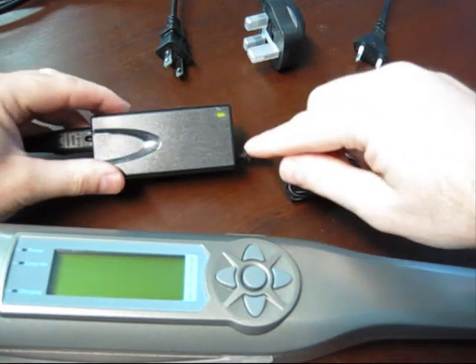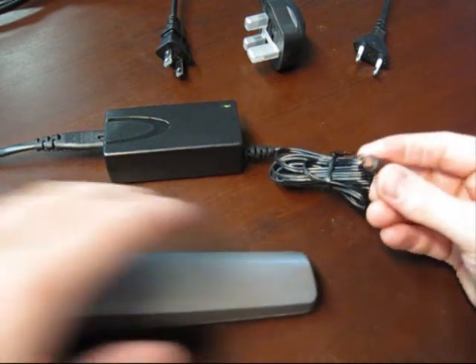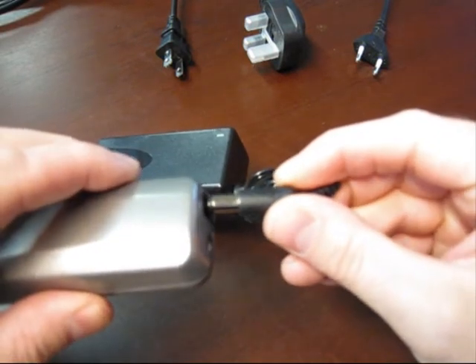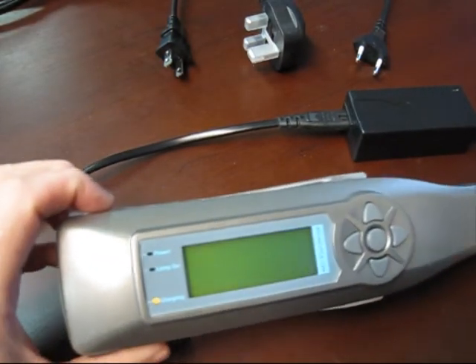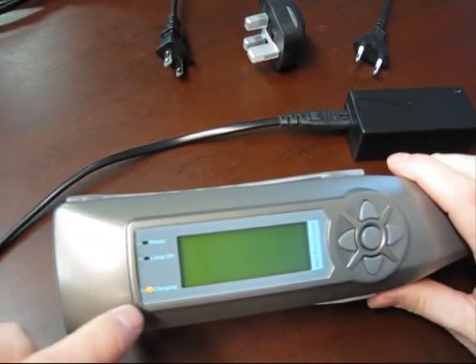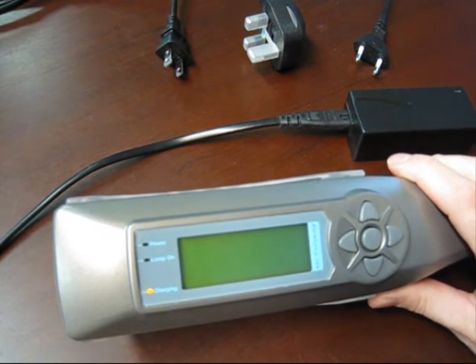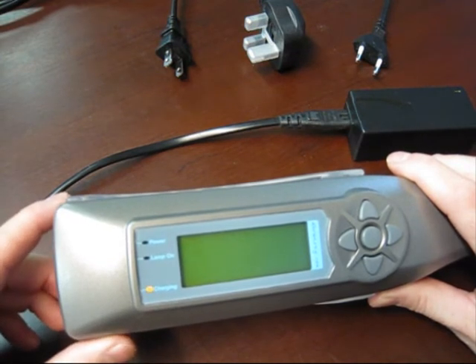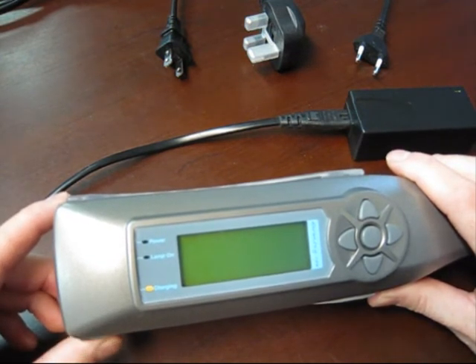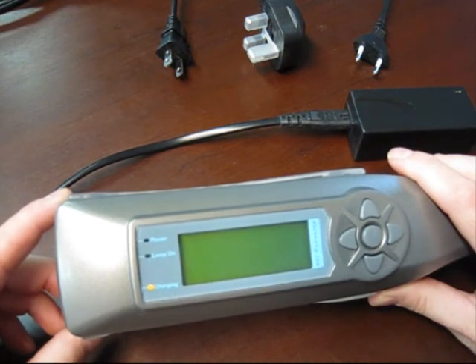The power transformer will show that it's on through a green light. Take the power transformer and plug it to the power outlet, which is the larger black connector on the Dermaray UV handle. When it's charging there'll be a yellow flashing charging light. Once the battery has completed charging the light will go out. On the first time you charge the Dermaray UV we suggest leaving it connected overnight in order to fully charge the battery for the first use.